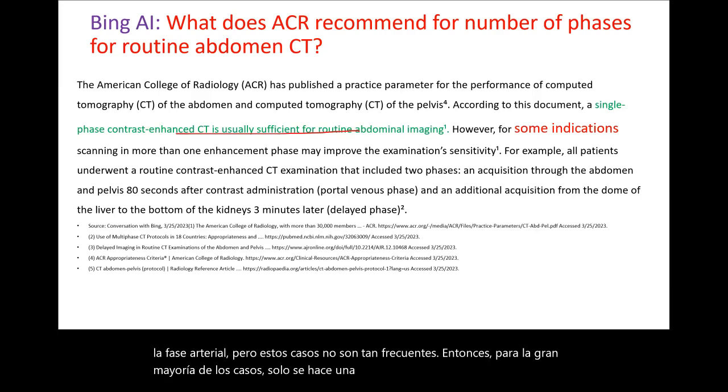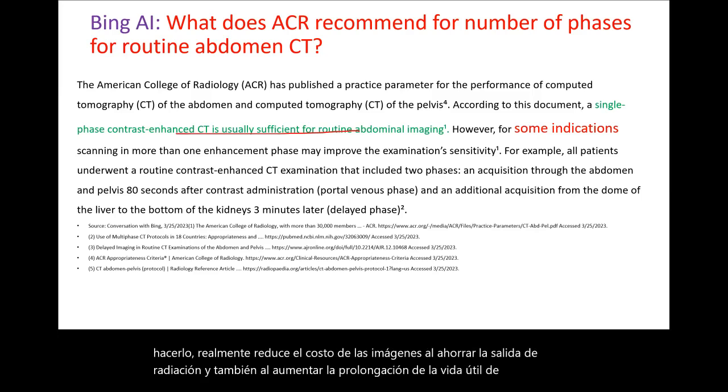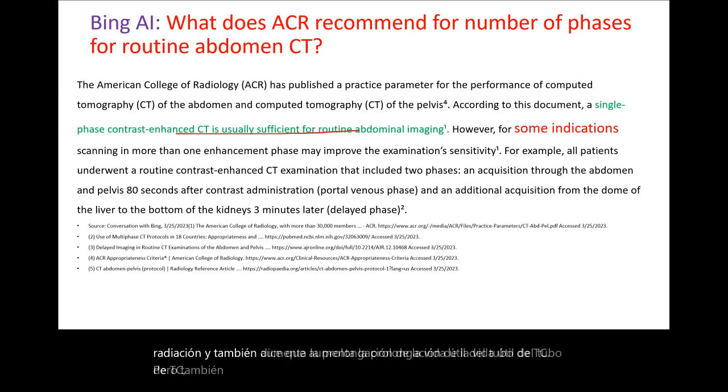And by doing so, you actually reduce the cost of the imaging by saving the radiation output and also prolonging the life of the CT tube. But you also importantly reduce the radiation dose to the patient.